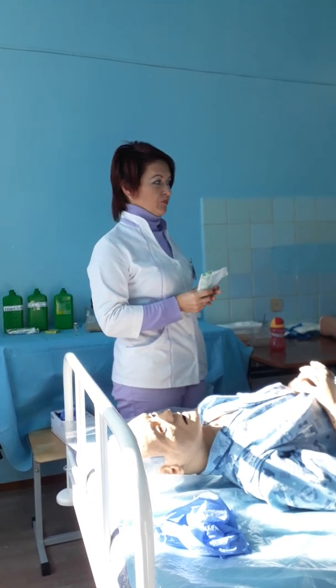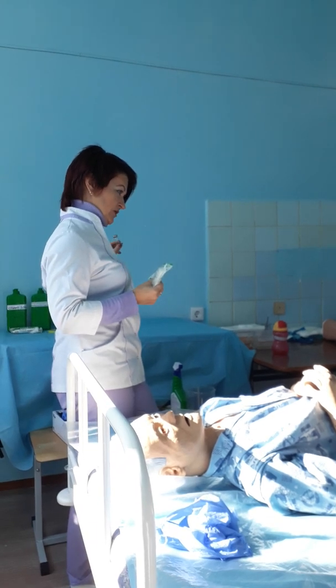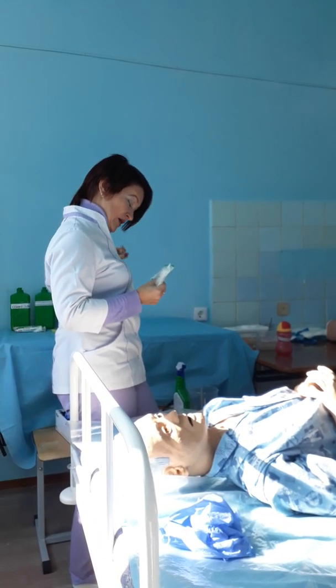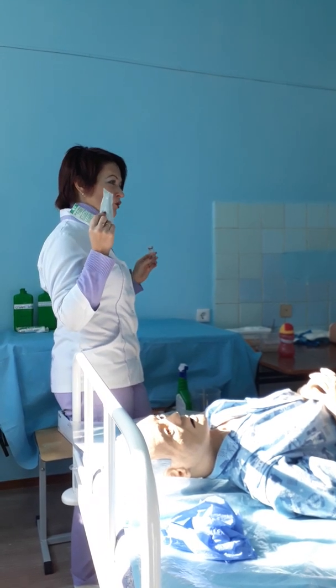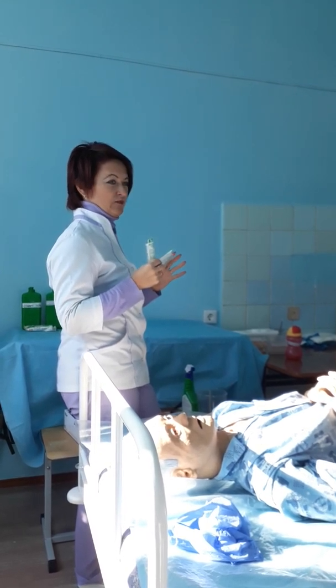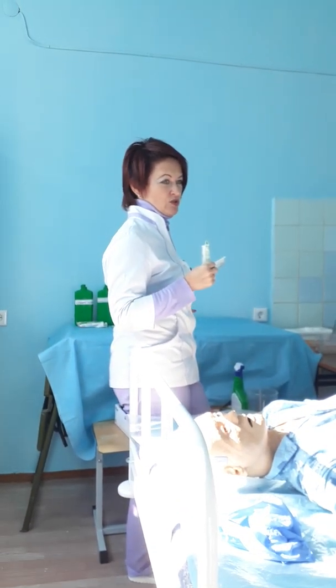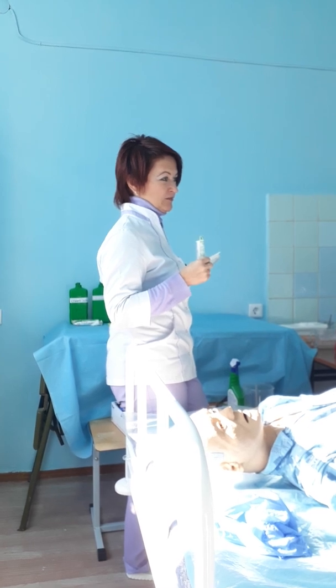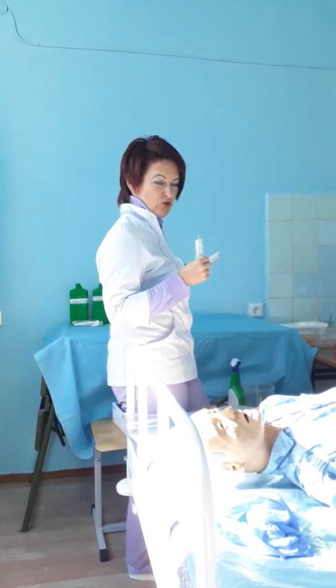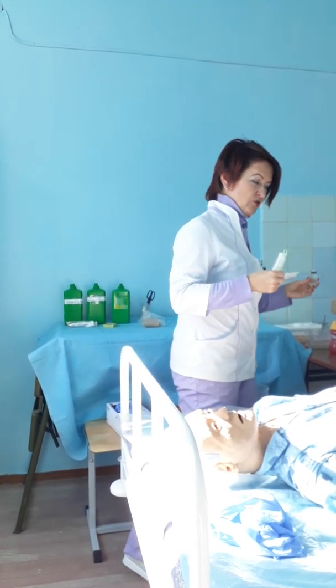Sometimes your patient needs a small dose intravenously, but more often this medicine needs dilution. You prepare a special solution, maybe glucose or sodium chloride solution, and you aspirate, for example, 1 milliliter of the main medicine, and add the additional solution in this syringe.